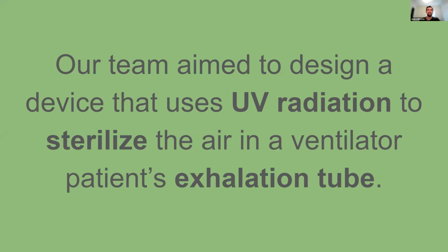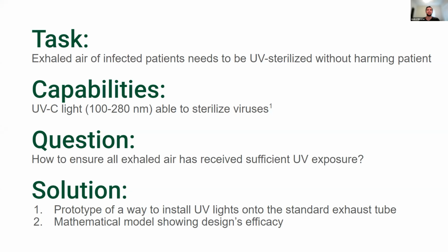So our team aimed to design a device that uses UV radiation to sterilize the air in a ventilator patient's exhalation tube. The task at hand was to take the air from the patient and make sure that this air is sterilized from any contaminants, to make sure that the air is safe for once it is excreted. We also had to take into consideration safety. We didn't want the dangerous UVC radiation to be harming the patient or the personnel that might be around the person.